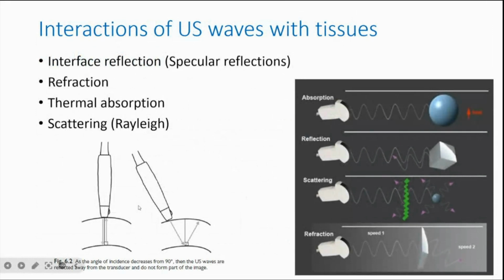So that's why it is very important in your orientation scanning, from the first talk by Malik on orientation versus block scan. When you want to do your orientation scan, it's very important that you adjust the probe so that you get the best image of the structure before you decide when and where to do your needling phase.